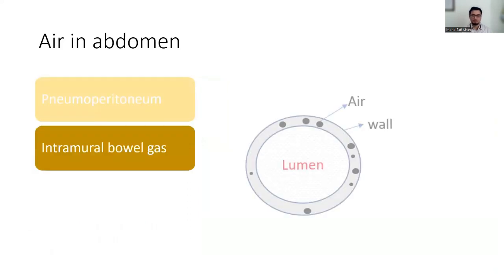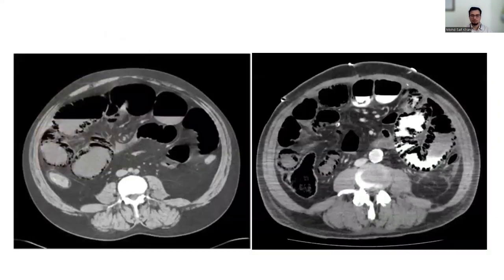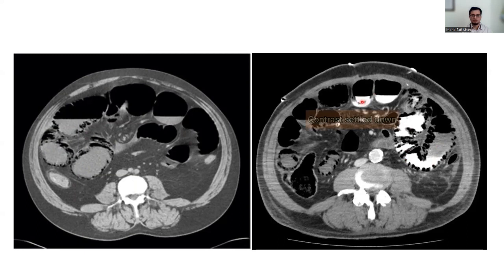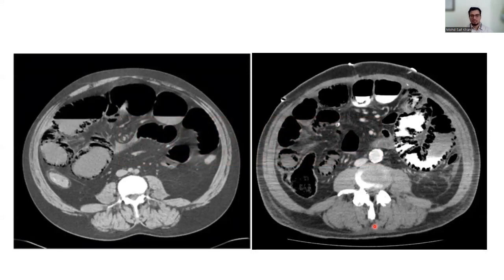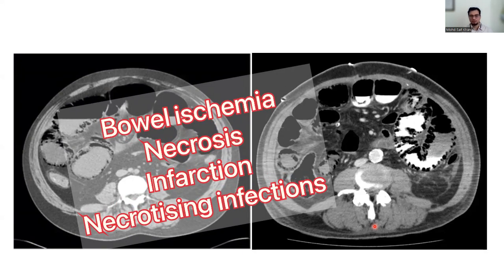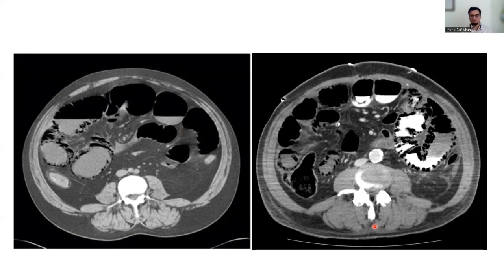After pneumoperitoneum, check the bowel wall for intramural air — that is, air inside the bowel wall. If you look closely at the bowel wall, it is studded with air pockets. This condition is known as pneumatosis intestinalis, which appears as gas bubbles within the bowel wall, indicating disruption of bowel mucosal integrity due to increased mucosal permeability. This may occur in bowel ischemia, bowel wall necrosis, or infections with gas-forming bacteria.